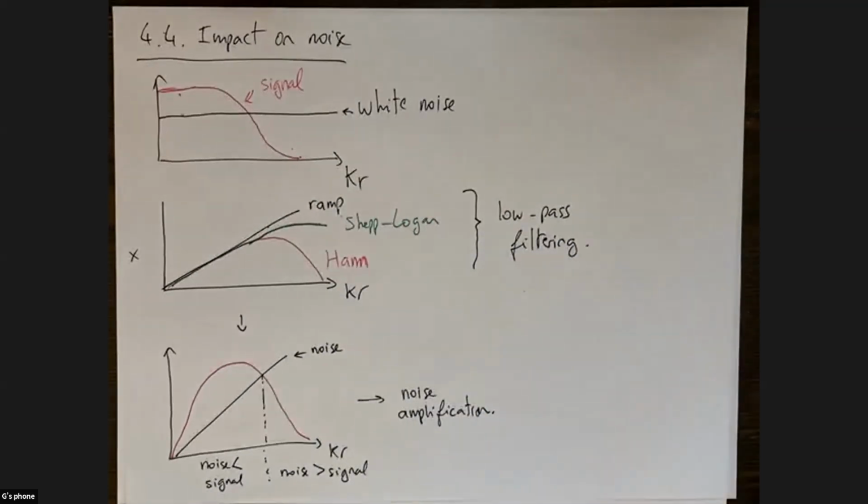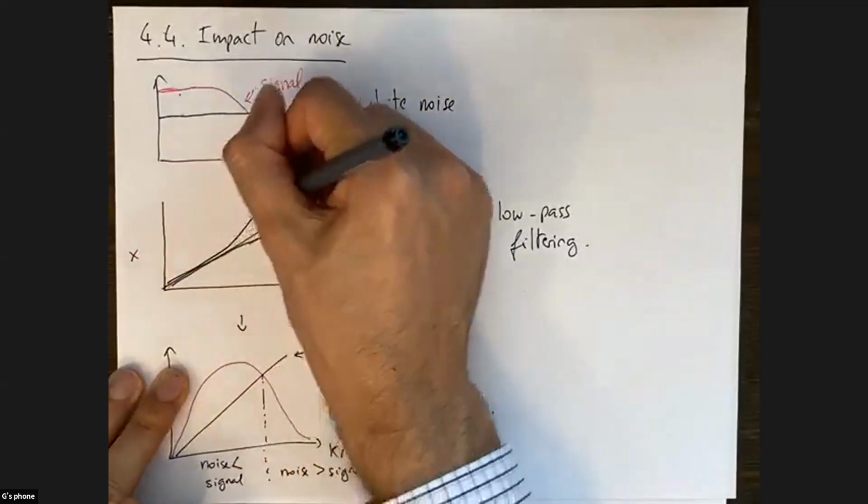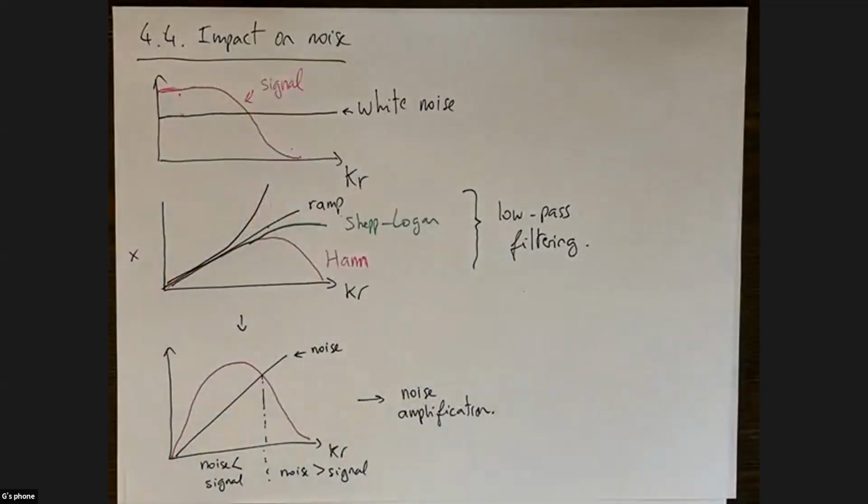If you did a parabolic ramp filter, like you suggest, you would affect the frequency content in your original image, and you would emphasize the high frequency detail, and your image will just look kind of artificially sharper, right?